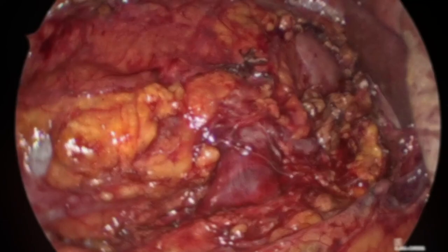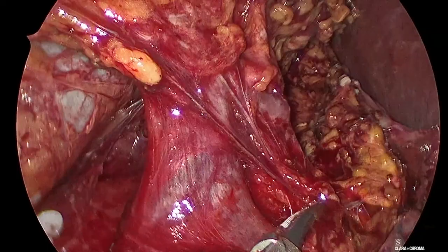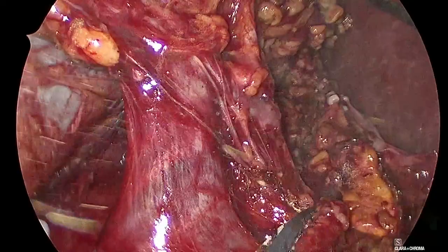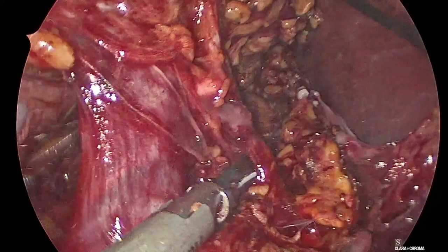Okay, so now we are really at the end. So we need just to dissect a little bit more. Now, one thing that I like very much, and I always have it ready in my room, is the endo-GIA, because if something goes wrong here, you can certainly use the endo-GIA and take everything en bloc. I know it's a little bit expensive, so you don't need to use it all the time, but it's nice to have it in the room. Probably not today, hopefully not today, but nice to have it in the room.